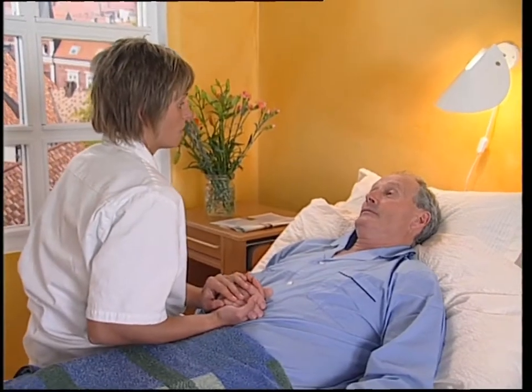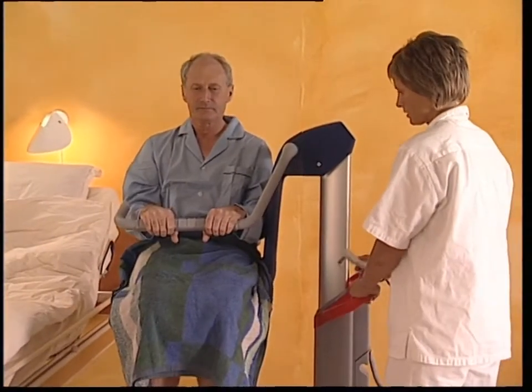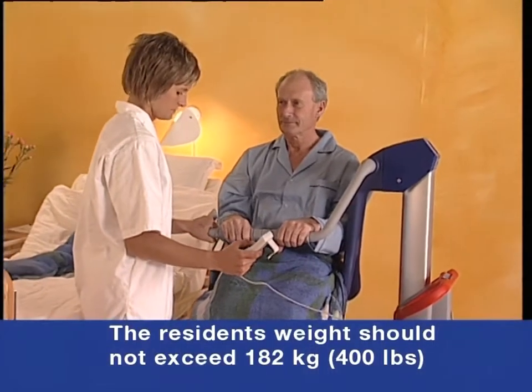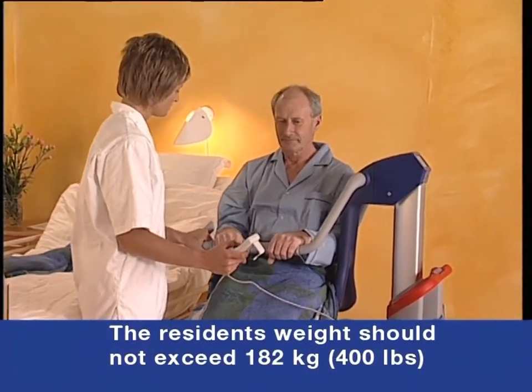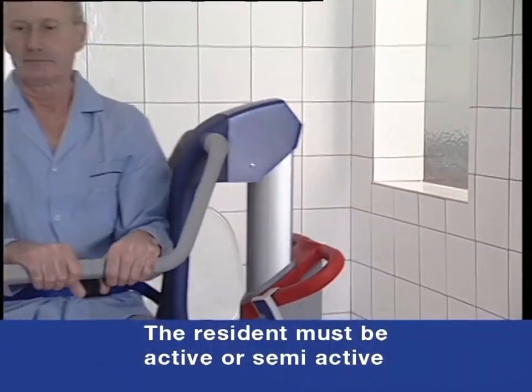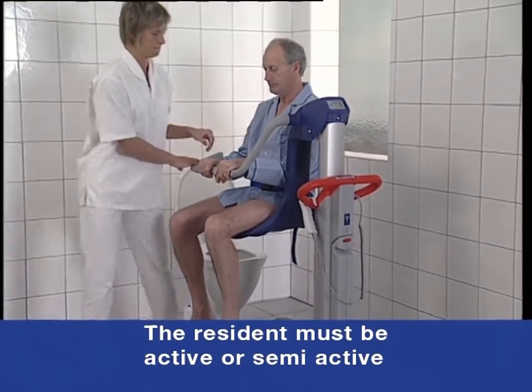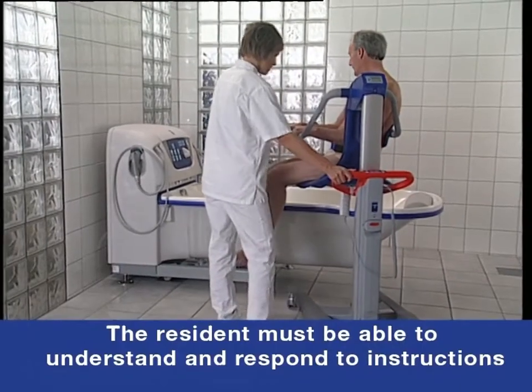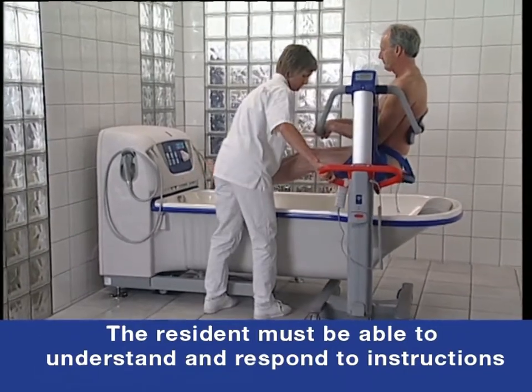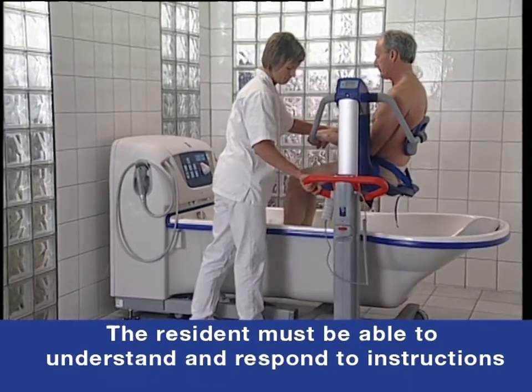We recommend that facilities establish regular assessment routines. Caregivers should assess each resident according to the following criteria prior to use. The resident's weight should not exceed 182 kilos or 400 pounds. The resident should be active or semi-active — that is, able to sit upright unsupported on the side of a bed or on a toilet — and should understand and respond to instructions to remain seated in an upright position. Should a resident not meet these criteria, an alternative lift should be used.